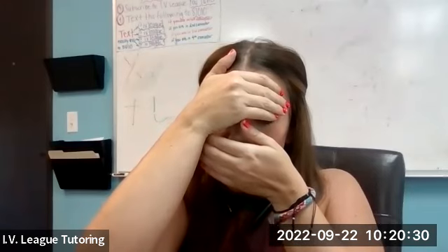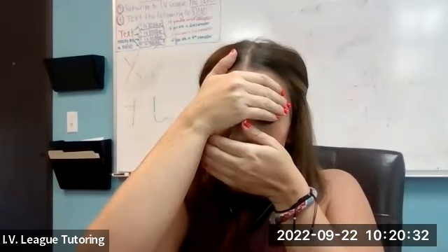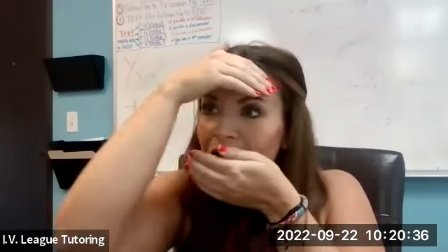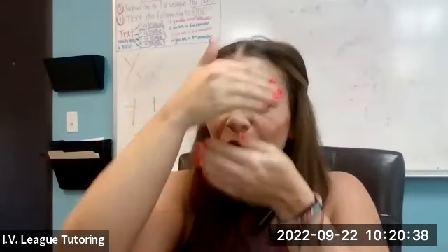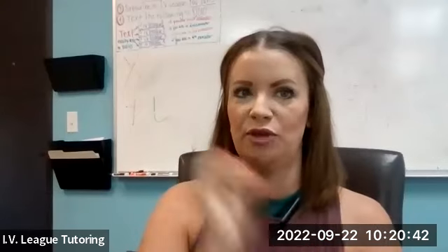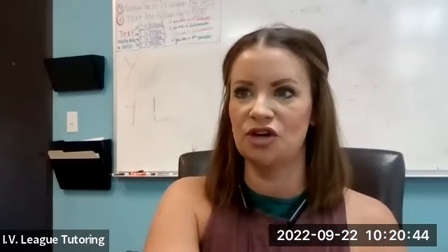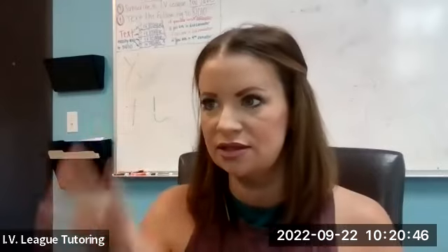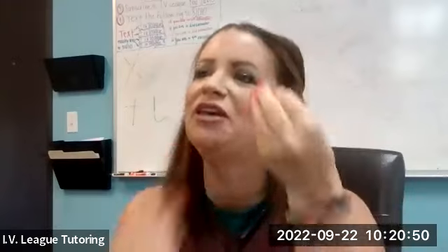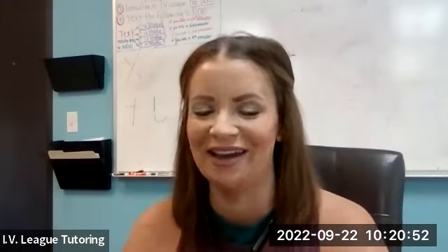Ventricular. Ventricular what? Depolarization. Depolarization, which means the ventricles are doing something. So the P wave means atria is contracting, right? Pump. And then the QRS, boom, boom, boom. PQRS, PQRS, PQRS. Got it? Yeah. Okay, I'll do a rep for you later.